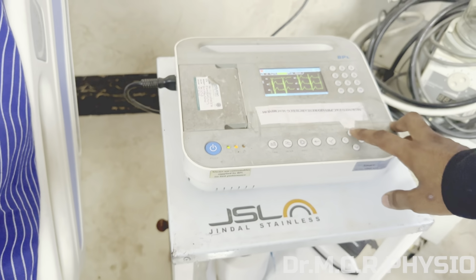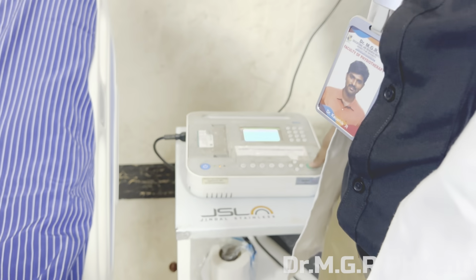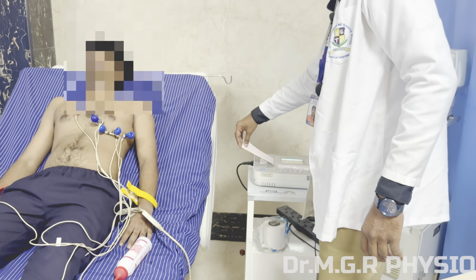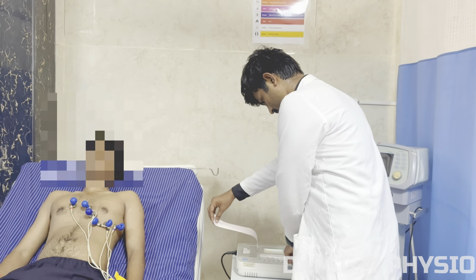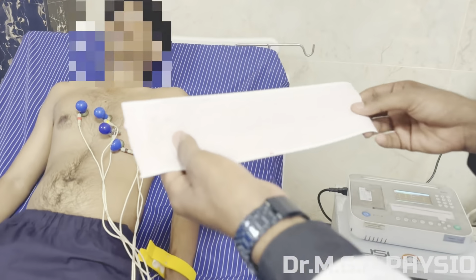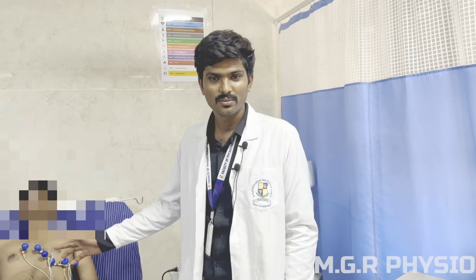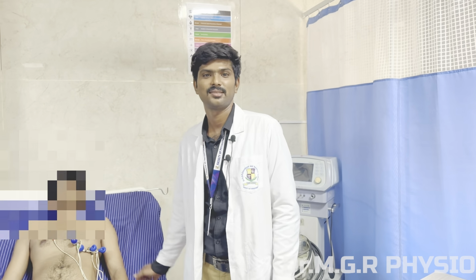Once you get a satisfactory ECG pattern in the machine, you give the print option and you get the physical printed version of the recorded ECG. This is the recorded version of the ECG which we saw in the machine. This is for documentation purposes. The main purpose of this machine is only for learning, for the UGs as well as the cardio PGs. Thank you.